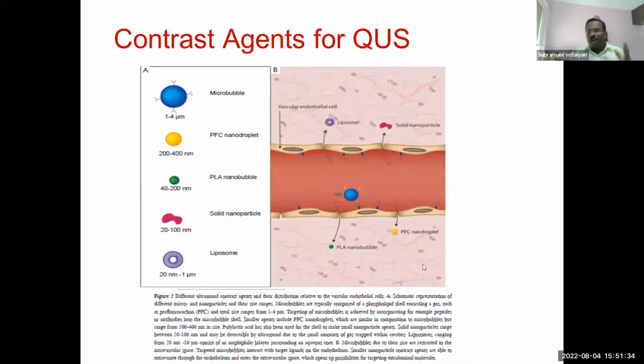So coming to the summary. Ultrasound-based IGRT is basically starting from target position verification to motion estimation and management. Including the integration of ultrasound into the radiotherapy workflow provides an exciting opportunity beyond the management of inter- and intrafraction motion, because it is low cost and high spatial resolution will improve that.